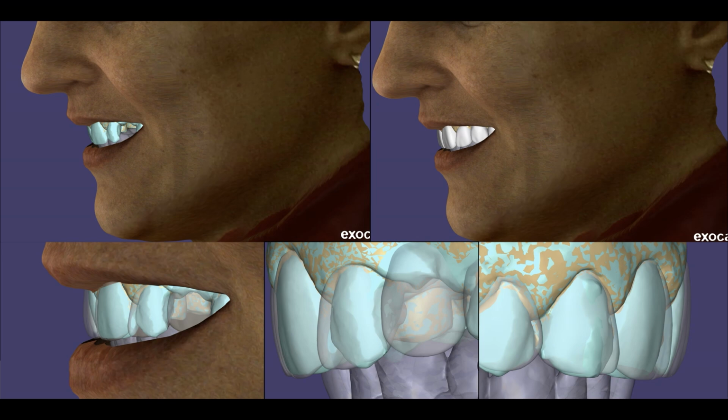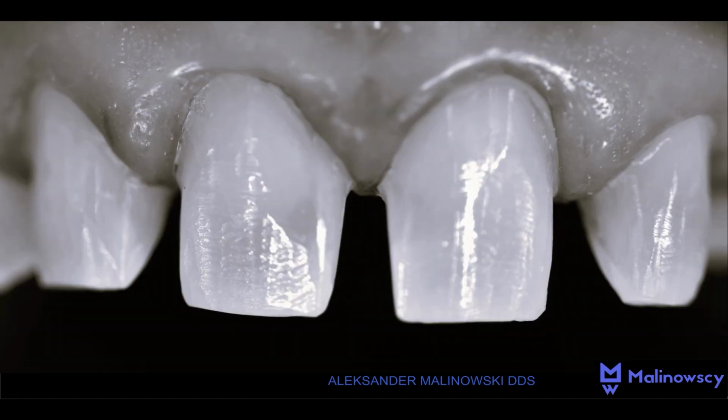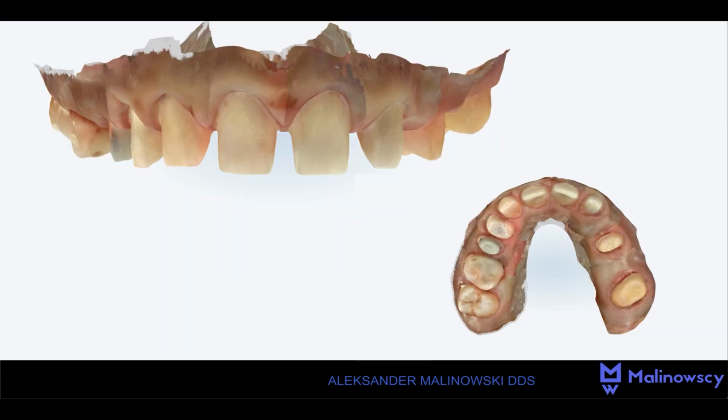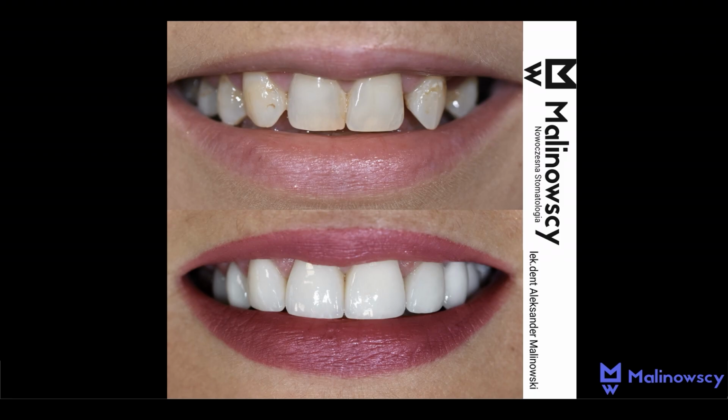In my opinion, the DSD should start to include the analysis of the profile, which is essential for achieving satisfactory aesthetic effects. Notice how minimal the preparation was in this case. I must admit that if I hadn't had the design in front of me, I would have ground these teeth down much more. Here we can see the intraoral scan with preparation, and this is the project overlaid on the preparation, visible from the front and from the profile. Here we present the comparison of the effects before and after the treatment.